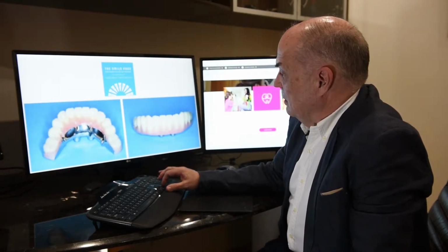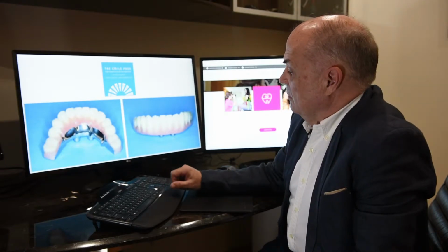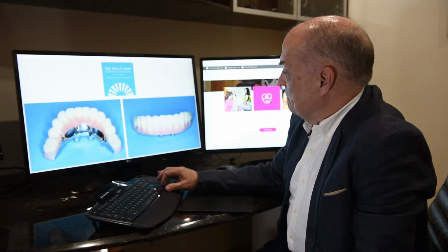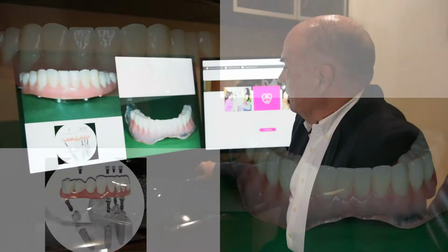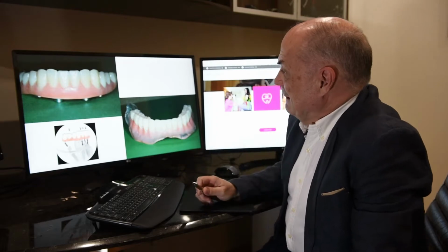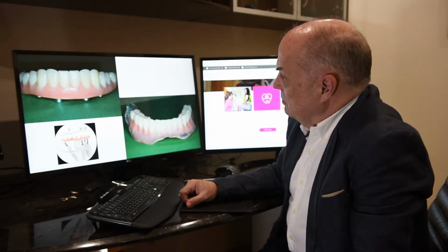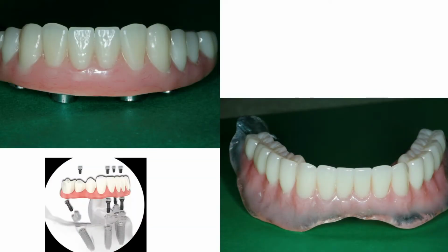It can be a good technique, but it's not the only technique. There are other ways to help people. So we're just going to go through and explain a few different options and the history of dental implants to somewhat. So this is some all-on-4 work on the top left-hand screen here. This is, again, what most all-on-4s are. They're high-quality denture teeth on a resin framework with metal substructure, where the metal holds it all together. And so that really is just a bolted-down denture.